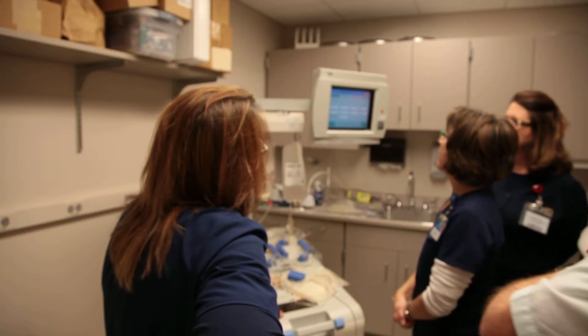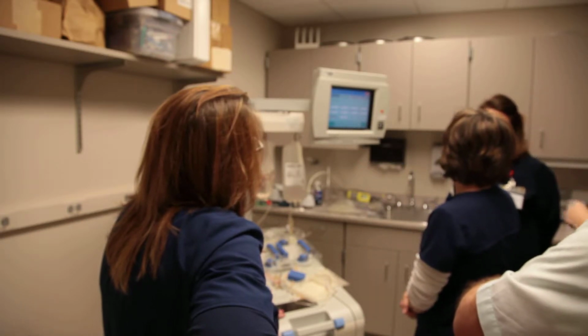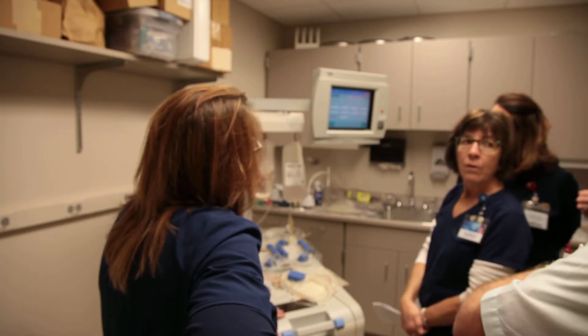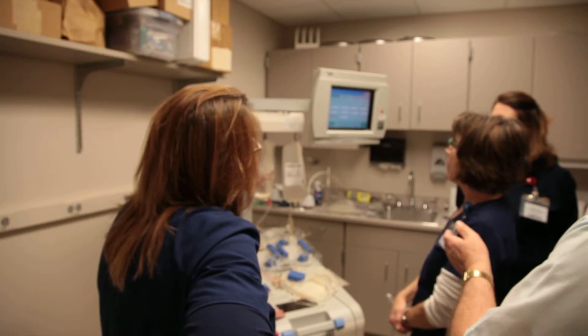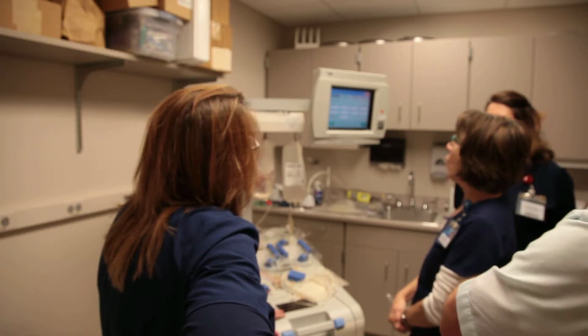For custom prime, if that would say yes, we would want to change it to no, but it automatically switches over. If it does a custom prime, it assumes that, but you do have the ability to do a reinfusion. When it gets to the end, it'll ask if you want to do a reinfusion, even though it knows it's not supposed to.